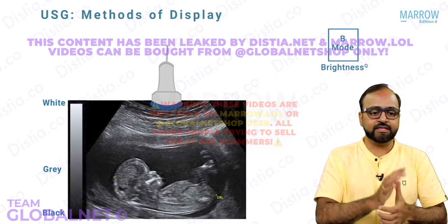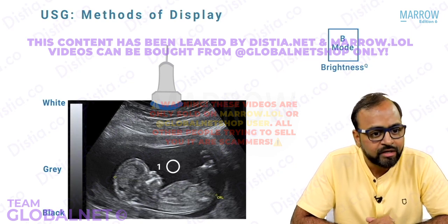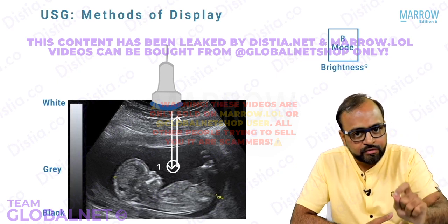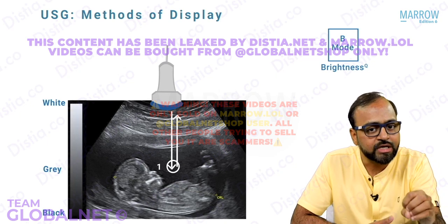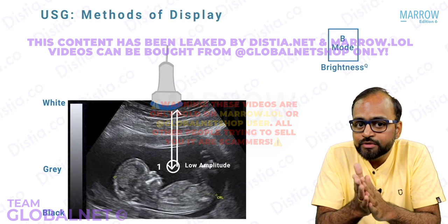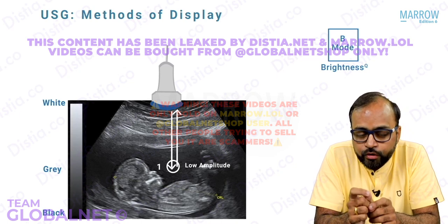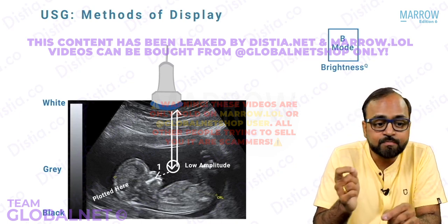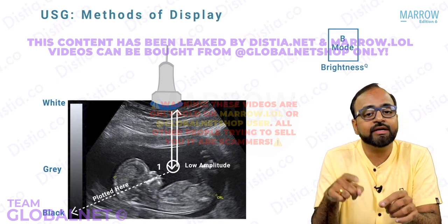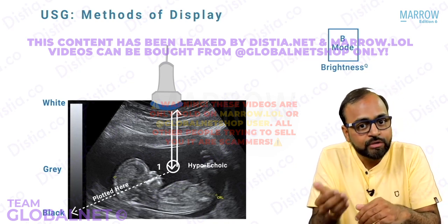Now what will happen? See here, let us take up an example. Let us look at the points that lie in this particular area number 1. The machine found that the amplitude of returning echoes arising from these points in area number 1 was a very low amplitude. I said amplitude value is given a brightness value depending upon this gray scale. So low amplitude was plotted on the gray scale at its bottom because of its low numerical value, and therefore how does this area appear? It appears black or hypoechoic. Do you realize that? The amplitude value is given a brightness value.